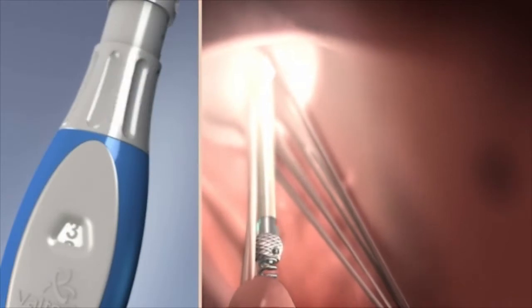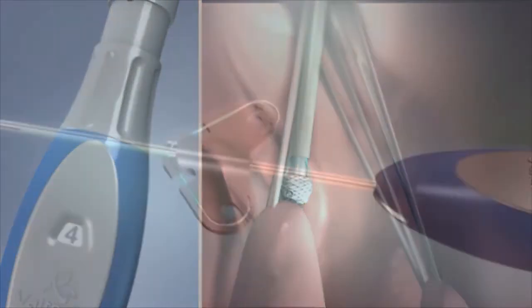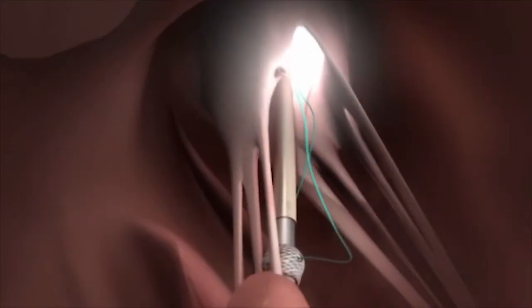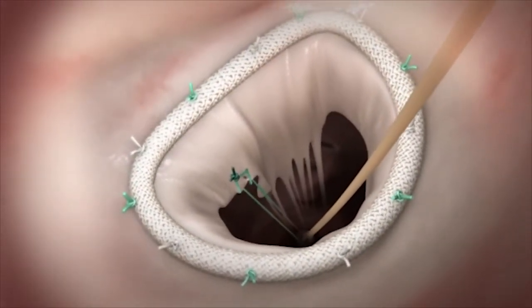By turning the device handle, the helix is anchored to the papillary muscle. Next, two surgical sutures are exposed and attached to the mitral valve leaflet. This is done exactly as in existing cord replacement procedures.